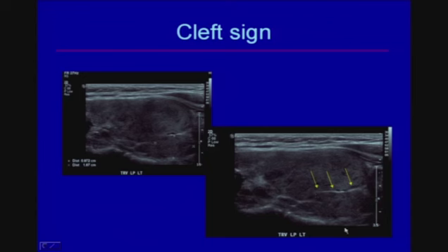This is just the thyroid parenchyma offset by this white line here in this patient with chronic lymphocytic thyroiditis. And this particular tongue-like extension, some people call this the tubercle of Zuckerkandl, a normal piece of the thyroid, becomes exaggerated as the gland begins to enlarge and look very heterogeneous in the setting of chronic lymphocytic thyroiditis. And so this is not a nodule at all. It's just an irregular area of the thyroid living next to this white line.